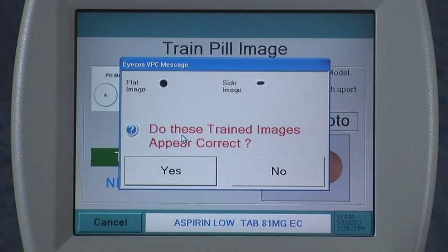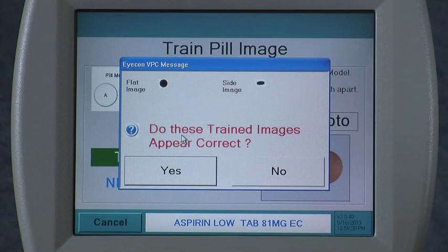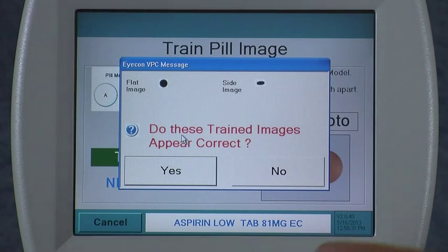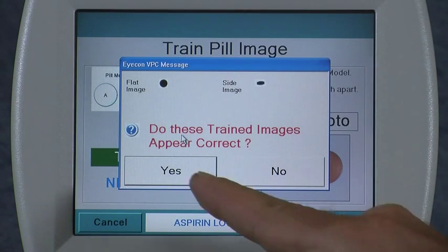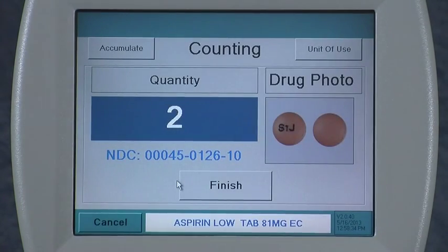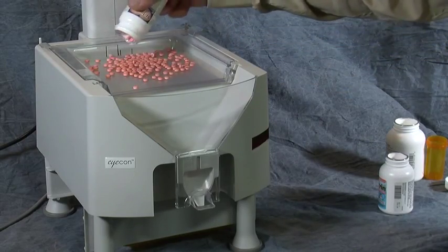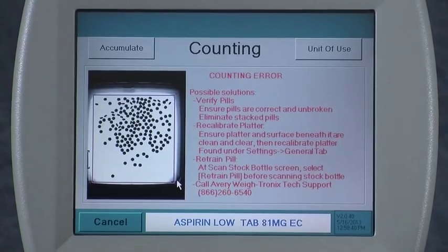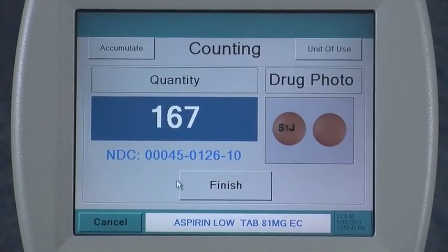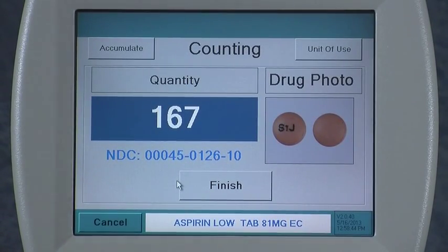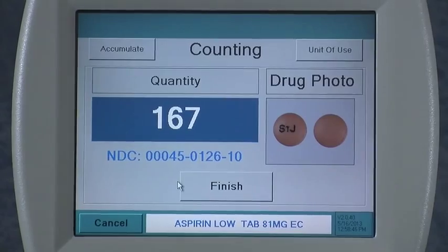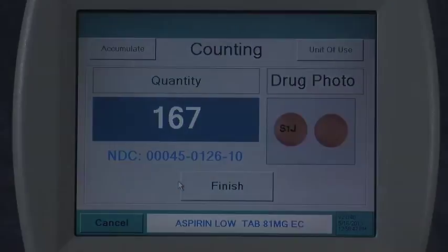The only reason they wouldn't look correct is if you had them too far off center or if they were touching each other — then it might combine them into one image. If they look correct, press yes, and it's ready to count that pill. Simply pour the pills on the tray and instantaneous counts are achieved. That concludes the process of training a pill on the ICON.